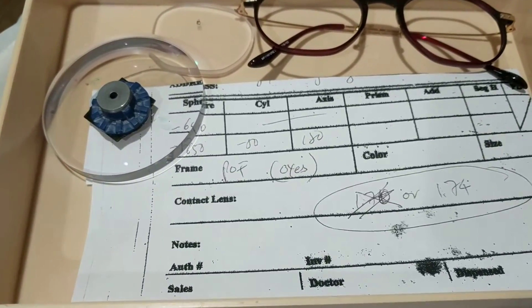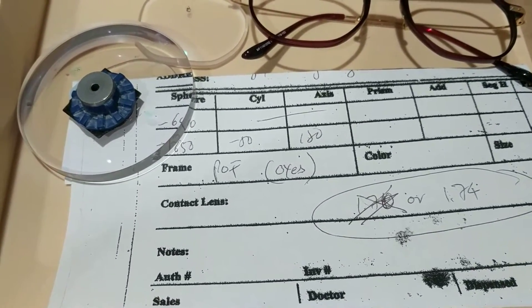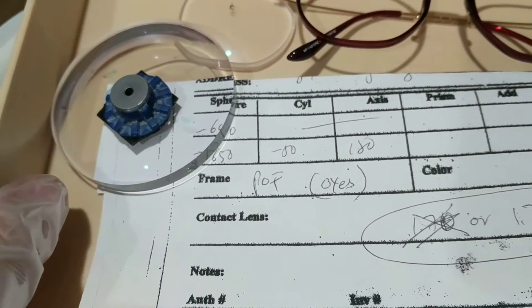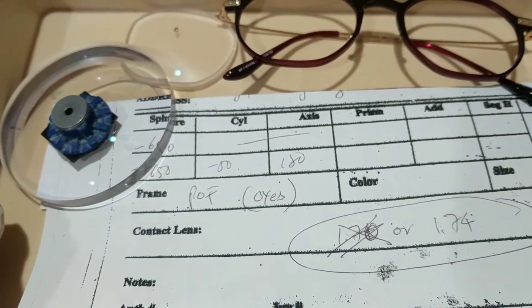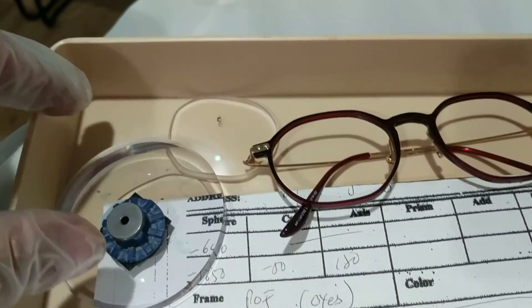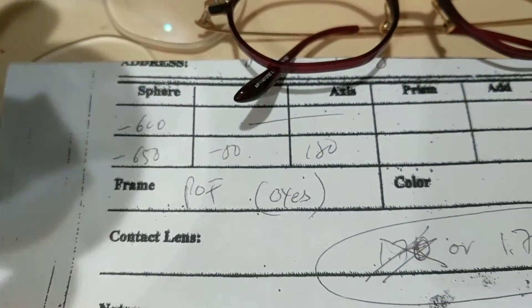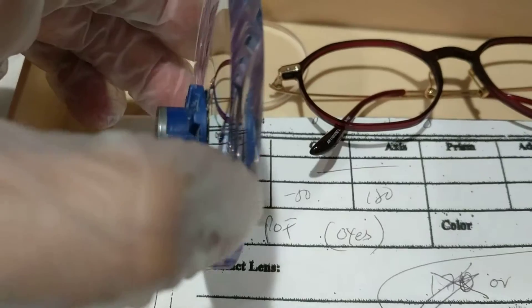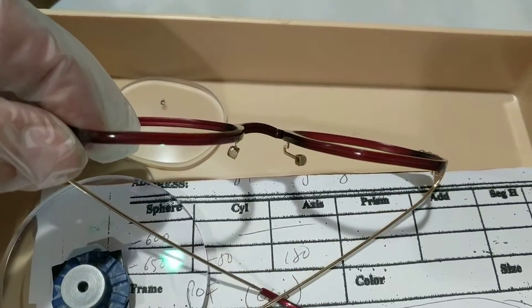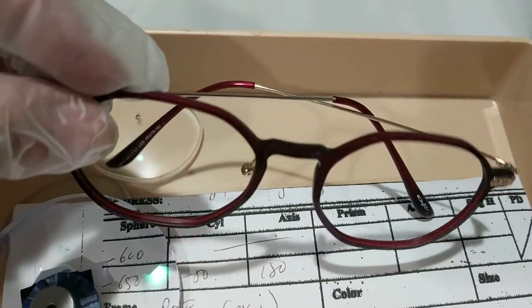Thank you for checking out another video. Last time we had high interest on high-index lenses, so I'm going to show you this video. This one is actually a high-index 1.70. We're going to put it in this frame — this is the prescription and this is the lens. The black stick frame is kind of thin also.